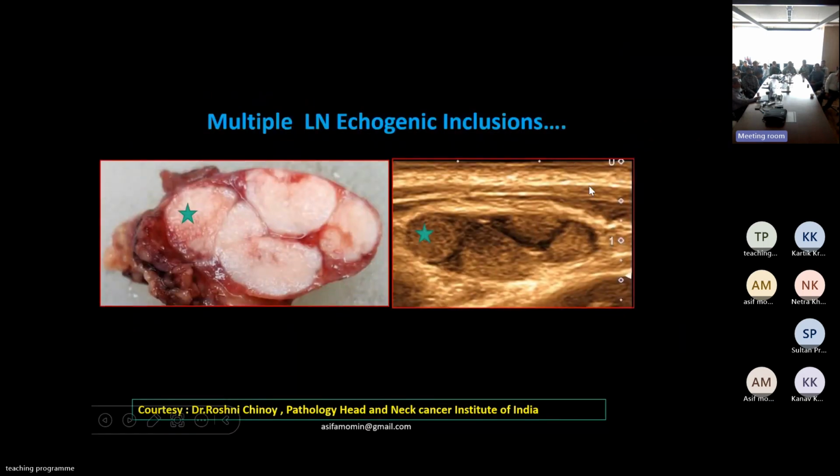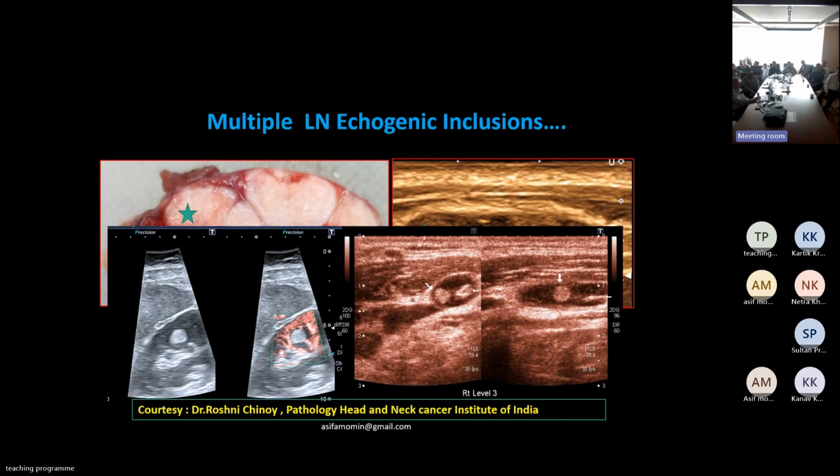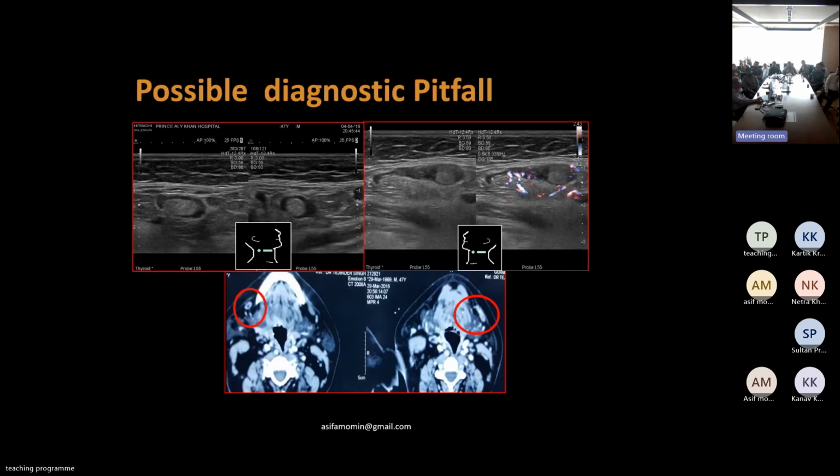Sometimes these multiple inclusions can look bizarre, and they are all metastatic deposits. Now the larger group of multiple inclusions can make that node look abnormal. So this is a typical one, nodular inclusion, which could look like an angiomyolipoma in the kidney, and this is how we tend to look for these particular inclusions, which allows us to pick up early diagnosis.